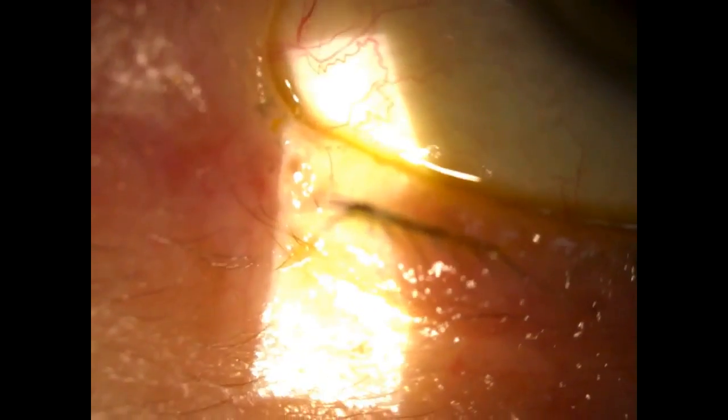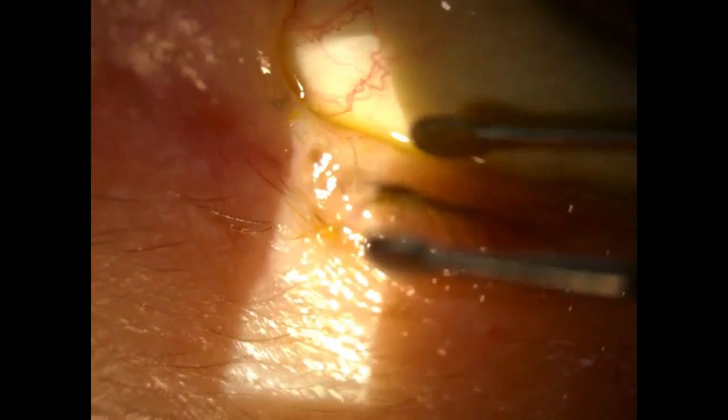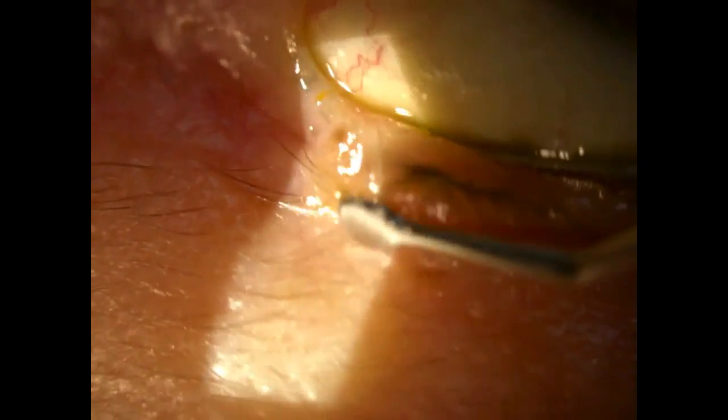Now I'm going to use the flex meibomian gland expresser. I simply have the patient look away, as if I was going in to epilate a lash. The expresser goes on the inside of the lid and on the outside, just below about the base of the lash line.